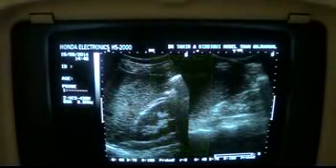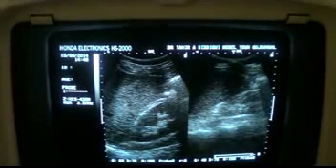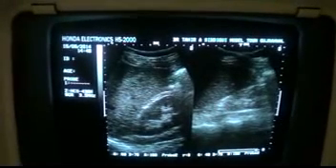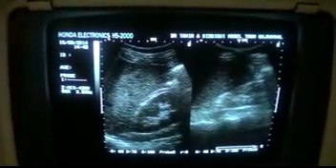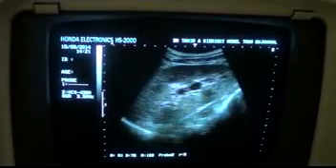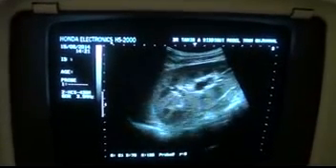So this is how we differentiate the echogenicity of the kidney: normal, raised, or decreased, and the corticomedullary differentiation. Thank you very much. This is a study regarding the corticomedullary differentiation or the echogenicity of the kidney.